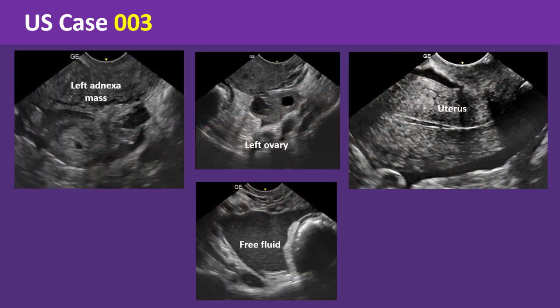Let's see the findings. There is an elongated left adnexal mass adjacent to the left ovary. This mass shows a heterogeneous echo pattern with echogenic components at its center that contains an anechoic area.